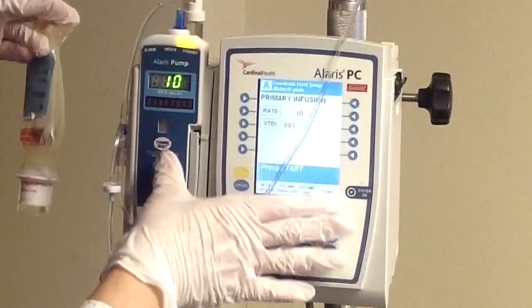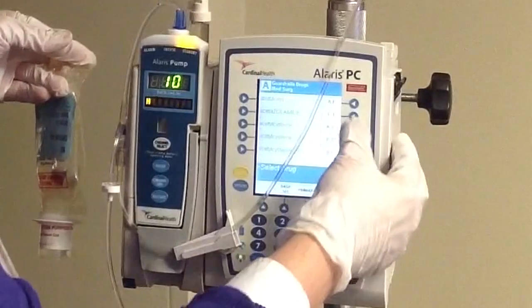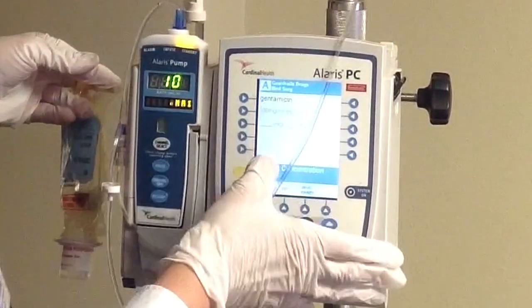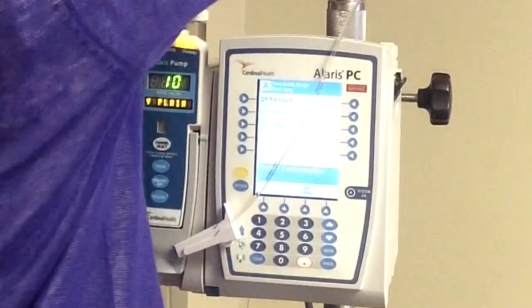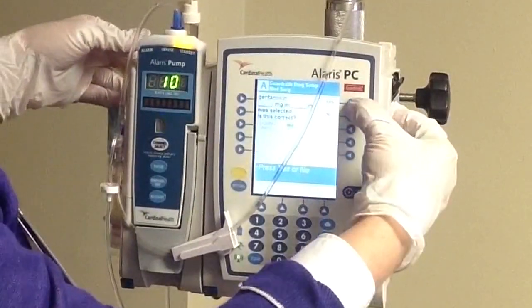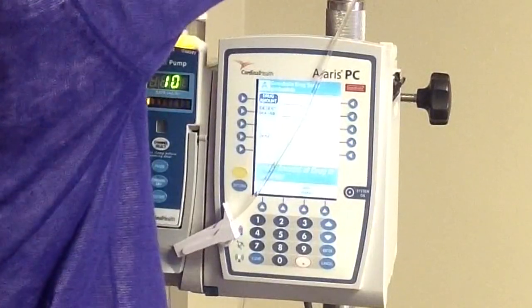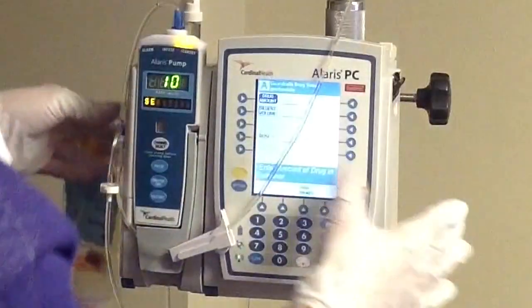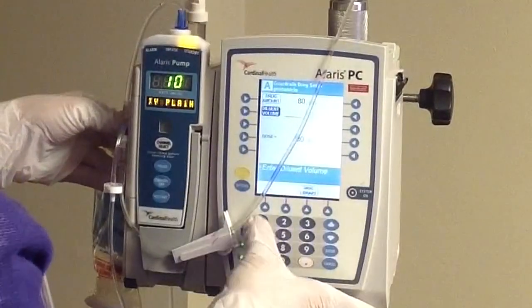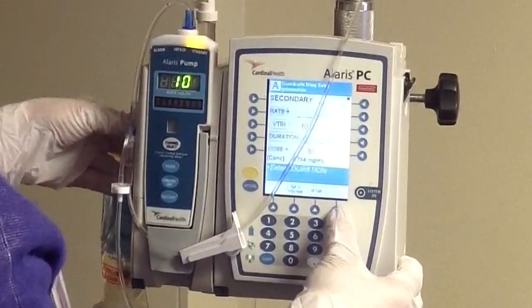Now she's going to program her pump, starting with the channel, hitting the secondary button, choosing her medication, which is gentamicin. This one's a custom drug, so she's going to have to do the blank milligrams and blank mils. She's going to confirm that's the right option. Her drug amount is 80 milligrams. Her diluent volume is 102 per her bag. She's going to hit next.